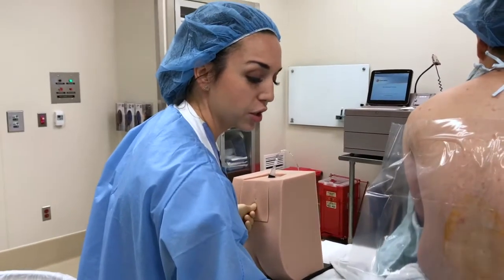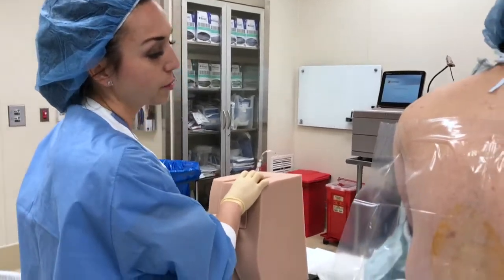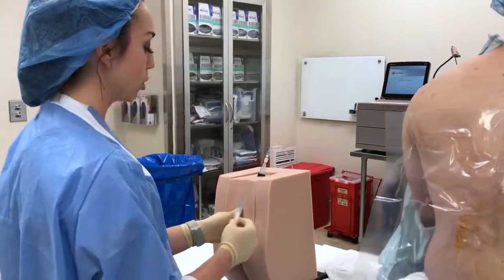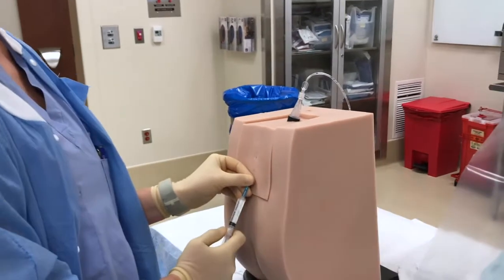All right, this first medication is numbing medicine called lidocaine to help numb your back, but it does sting quite a bit. I'll tell you before I go. Ready? 1, 2, 3. And then remember, make a really good skin wheel.